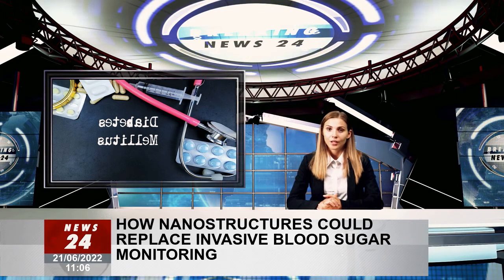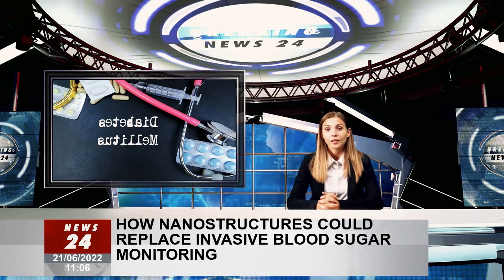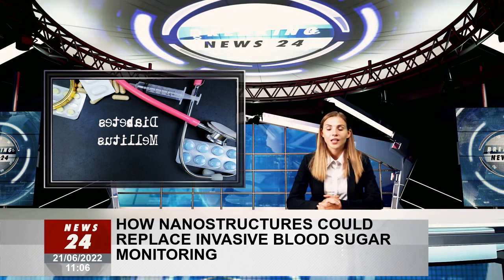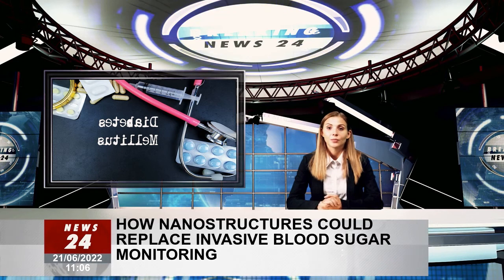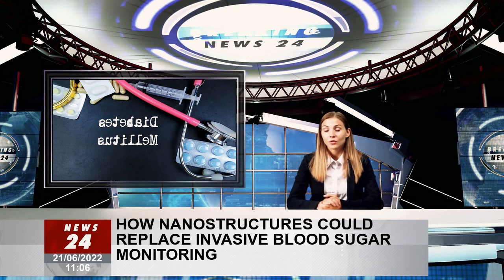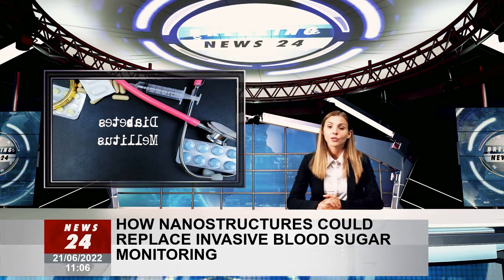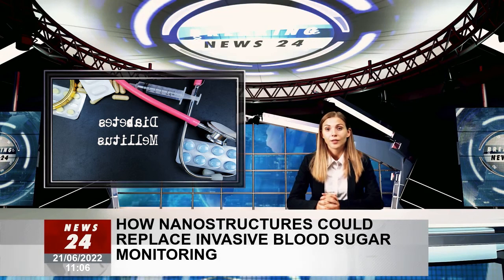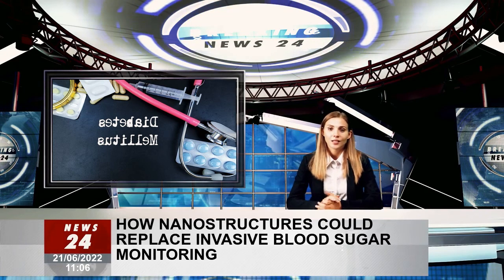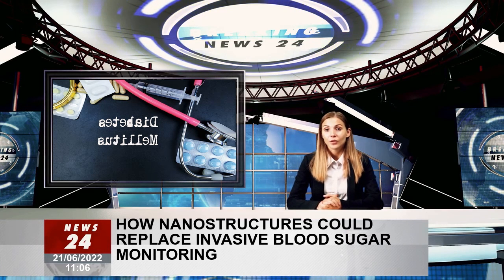In addition, it has been established that there is a link between blood glucose levels and VOC concentrations, such as acetone. As a result, acetone breath measurement can give greater diagnostic supervision over the status of a diabetic person than measuring sugar levels alone. Traditional exhalation evaluation strategies focus solely on spectrometric methodologies. However, with the improvement of gas sensors, they have become less attractive from a medical point of view.